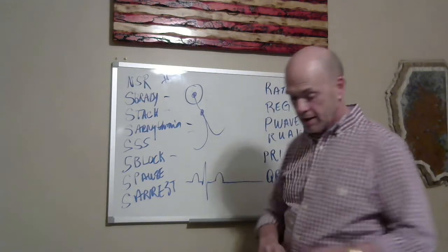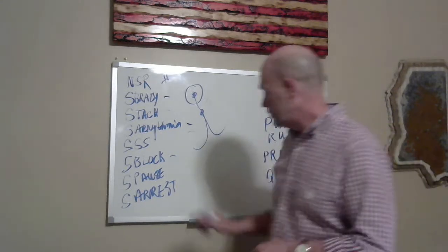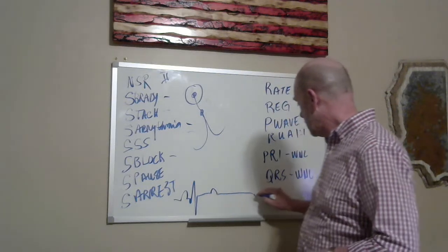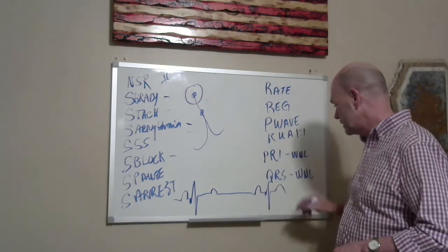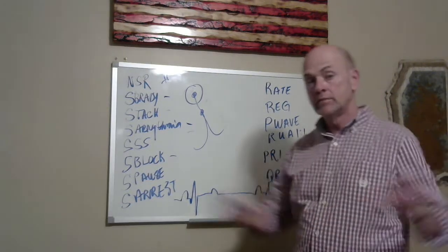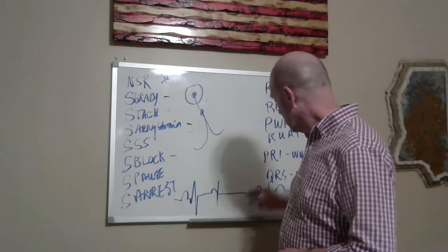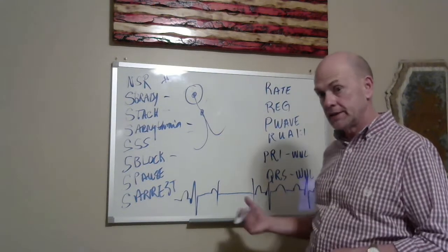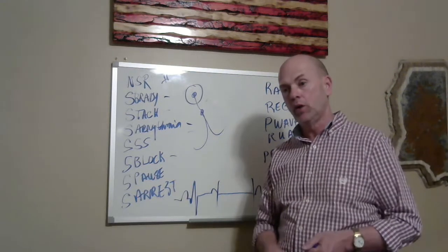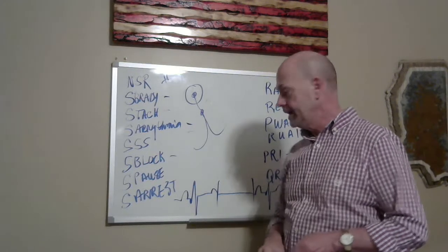And then we will see that the block starts over with a P, QRST. And we may see a couple of P, QRSTs. And then you can see another long period where there's no electrical activity. If you look at the monitor and just glance over, you may see what looks like asystole because it is asystole. There's no electrical energy being stimulated through the normal conductive pathways.